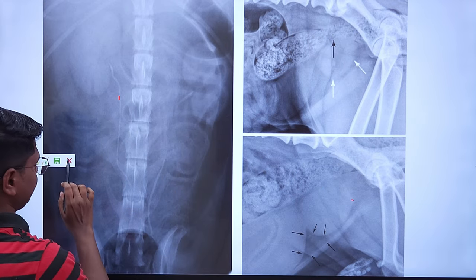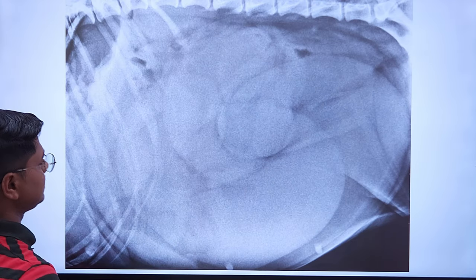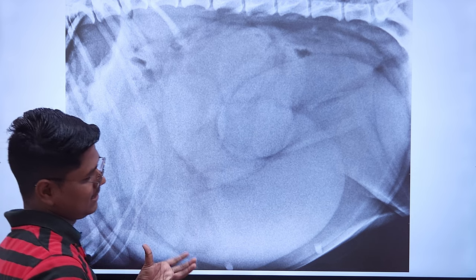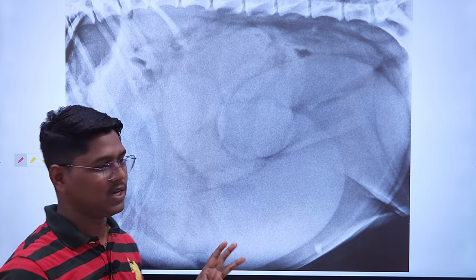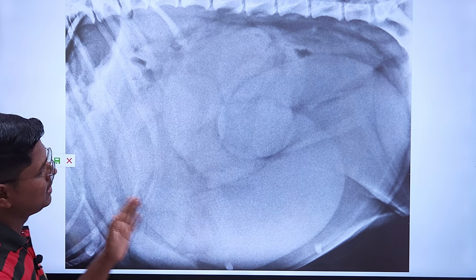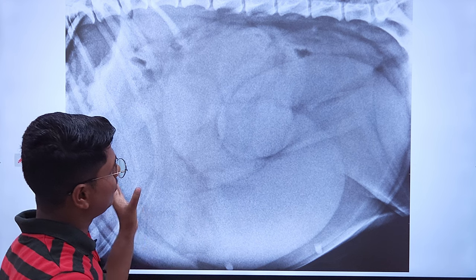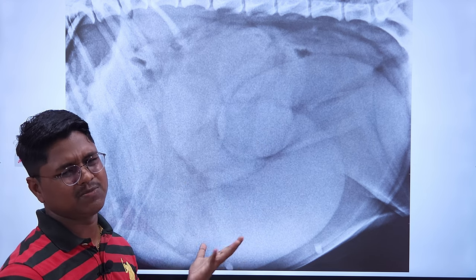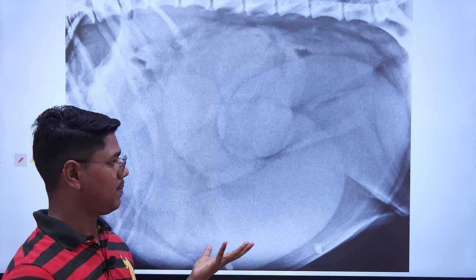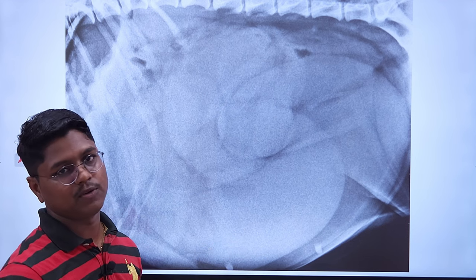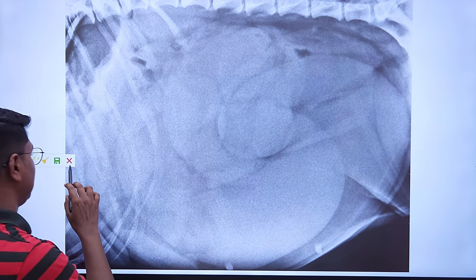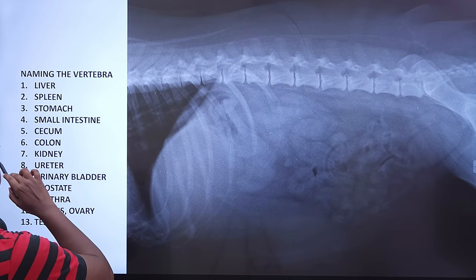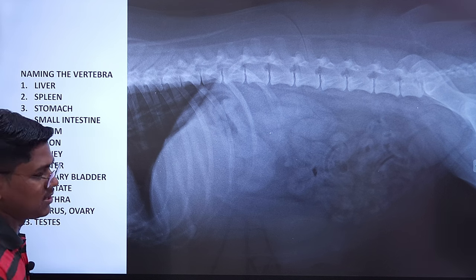This is a case of pyometra — all the organs are shifted cranially and the entire abdomen is filled with the enlarged uterus containing pus. This is a pathological finding; normally the uterus is not visible on radiographs.